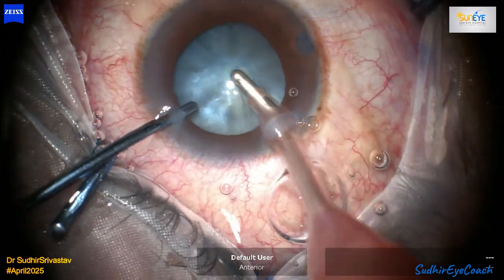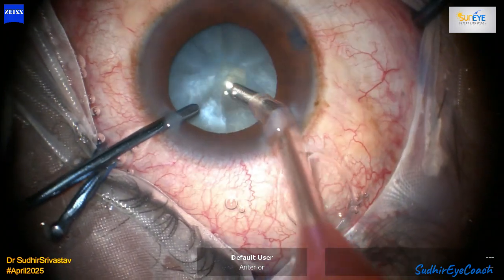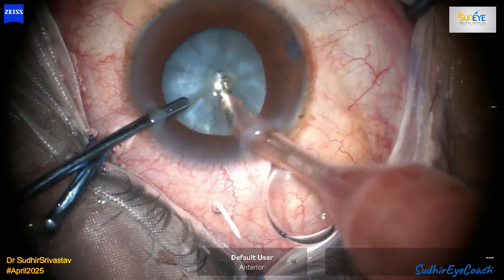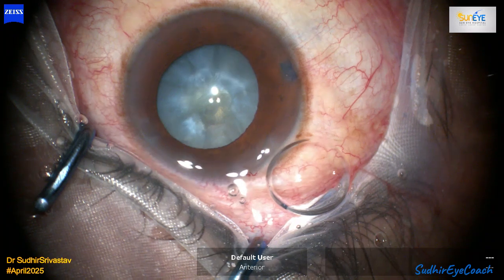I proceeded with phacoemulsification and fragmentation using the moderate size capsular rhexis. After completing nucleus fragmentation and cleanup, I implanted a single-piece hydrophobic lens — the Clareon lens from Alcon was implanted in this case.